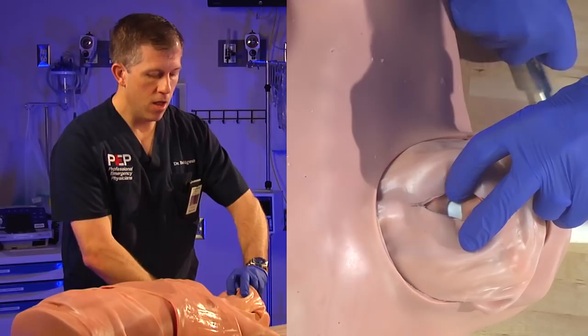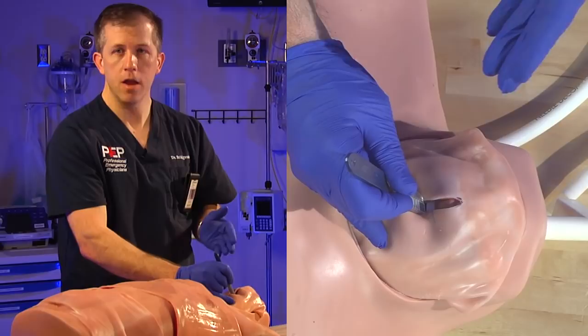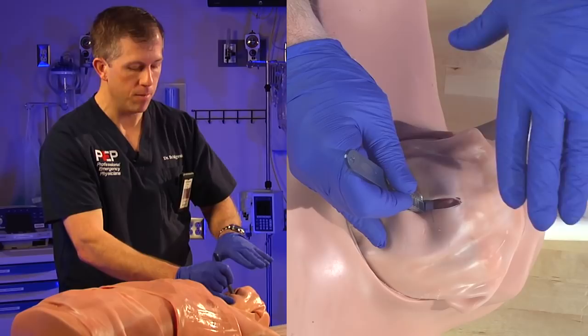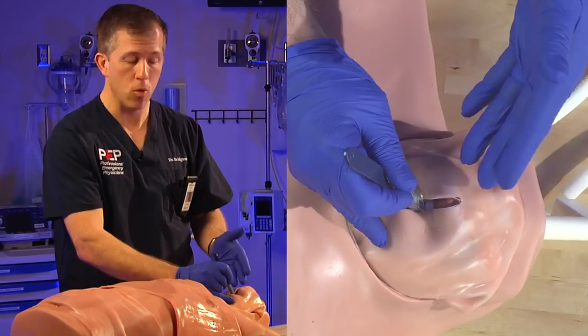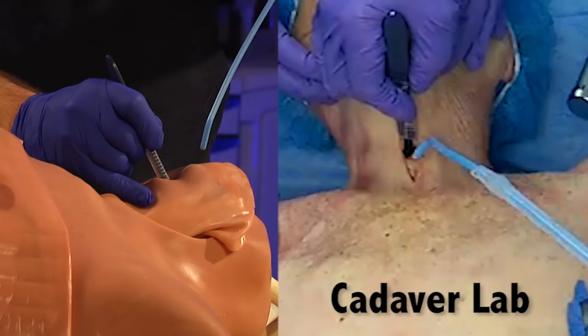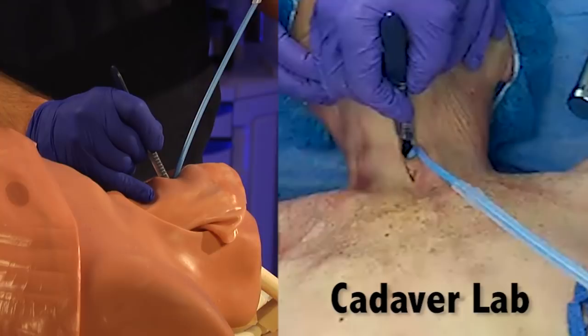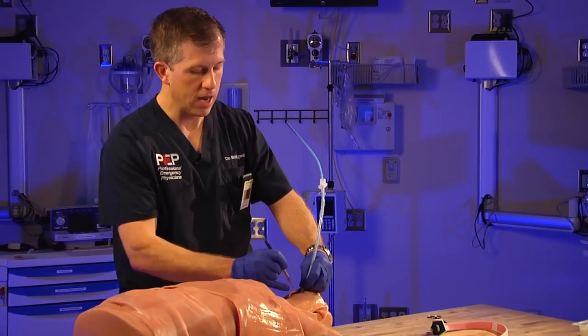Once you've found the membrane, make a horizontal incision through it — basically just a puncture and a small incision. At this point, having your personal protective equipment in place is critical because when you pierce that membrane, blood and saliva may shoot through — directly exposing you and your partner to bodily fluids. This scalpel does not come out until you've got another marker inside the patient's airway. You've already got your bougie ready — insert it right adjacent to the scalpel.